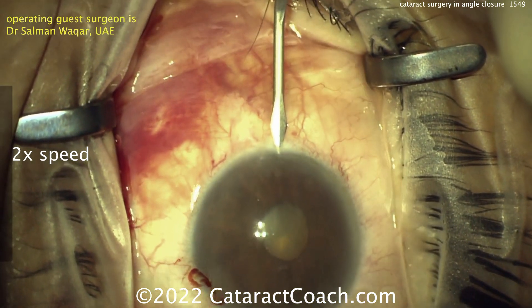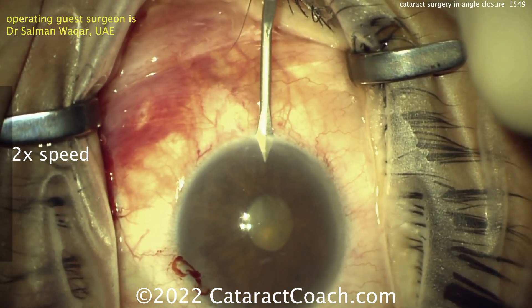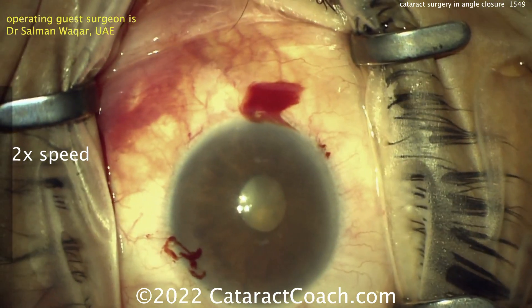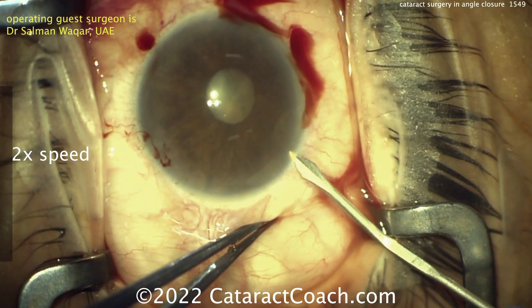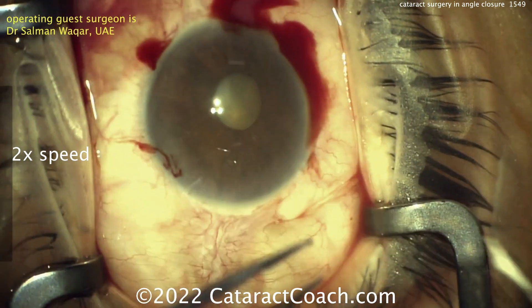Starting off with making multiple paracentesis incisions, and that's probably going to be to place some iris hooks. Now, if you are making these incisions for iris hooks, be sure to angle them downward like he's doing here — that's very helpful. With iris hooks, you can put four of them or even five of them.